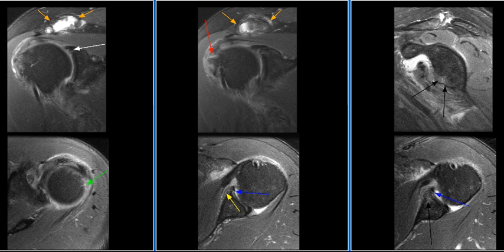MR findings are consistent with a detached inferior glenohumeral ligamentous complex injury called a Perthes lesion.